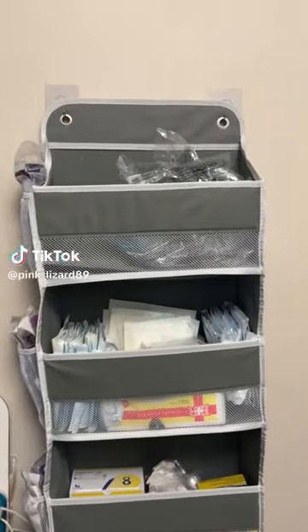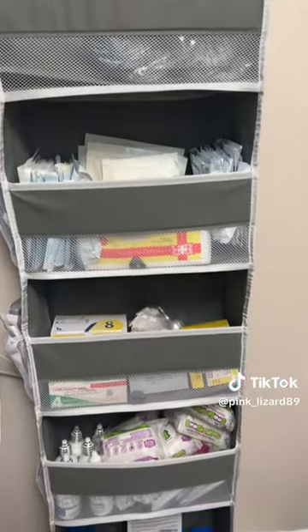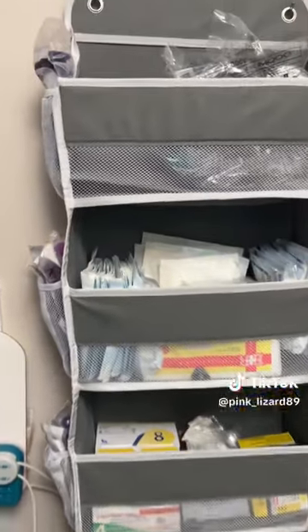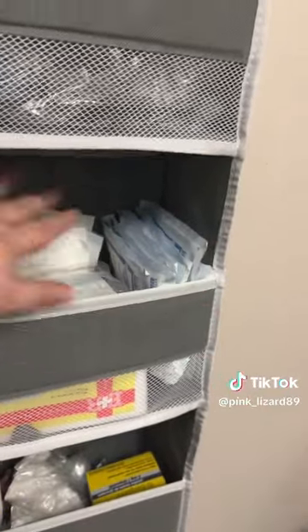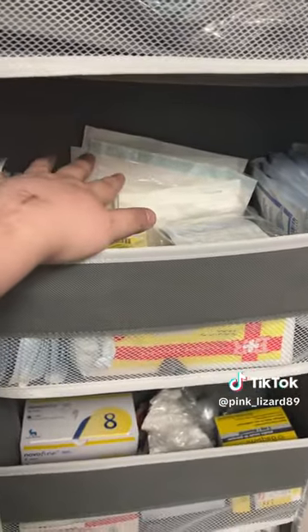So those of you who were wondering what I wanted the organizer for, here it is — to organize all my tubi stuff. Bags are up top. I've got my gauze here. This is split gauze, and this is regular gauze, along with this, which I'll be using after surgery for the old stoma.